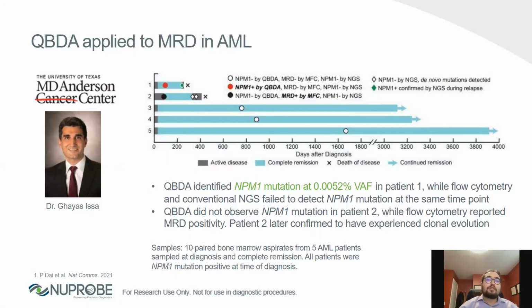But I think the content itself of the panel may need to be expanded to function as a clinical MRD assay. And I do want to also be clear that all of these samples here were used retrospectively. Currently, all of our products are for research use only.